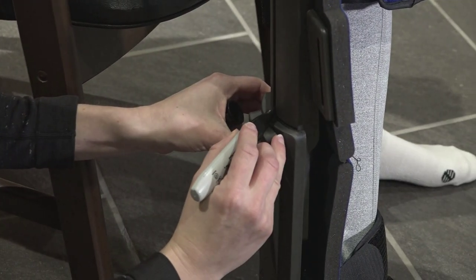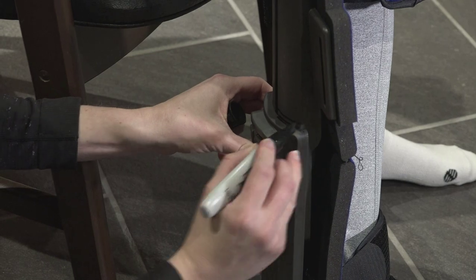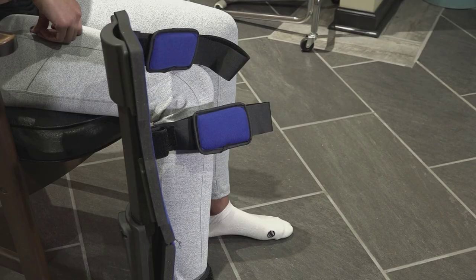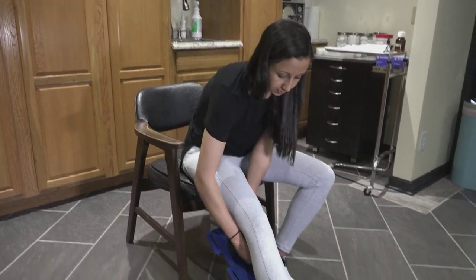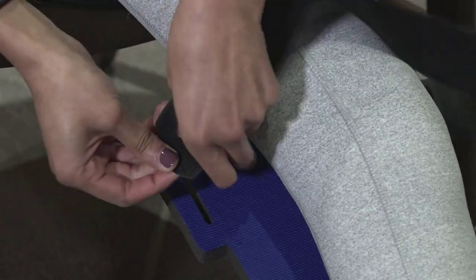We recommend marking the proper height for each patient on the post. This way they know where to set the post when using the brace at home. Once the extension post is properly adjusted, swing the post behind your leg and fasten the leg straps — one strap above the knee and one strap below.